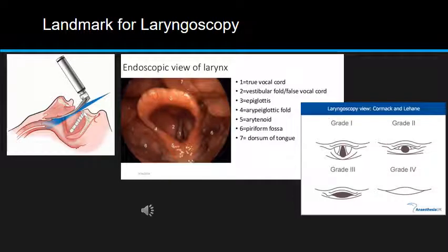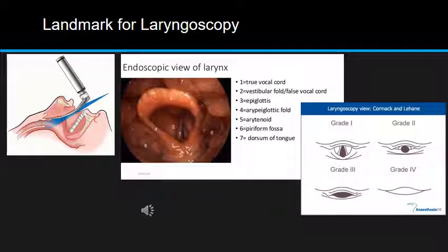For laryngoscopy, you should have a landmark. My landmark is the tip of the epiglottis. When the tip of the laryngoscope is within the vallecula — the anterior part of the epiglottic cartilage — you will be able to see the epiglottis. By holding the laryngoscope handle toward the feet of the patient and slightly anteriorly and upward, you can see posterior to the epiglottis: the vocal cords. Based on your view — if you can see the vocal cords, posterior commissure, and anterior part, it is Cormack-Lehane grade 1. If you cannot see any part of the epiglottis, it is Cormack-Lehane grade 4, indicating a very difficult intubation.